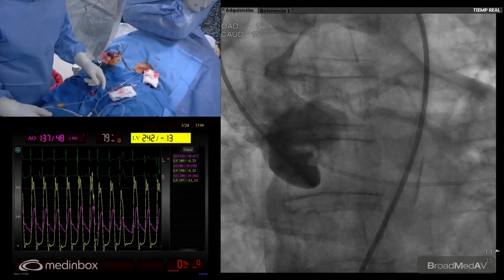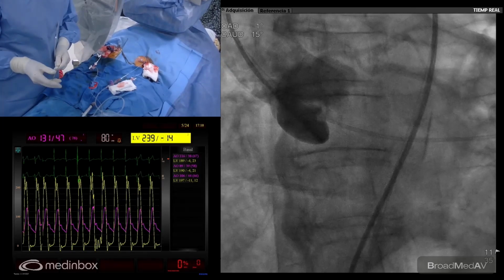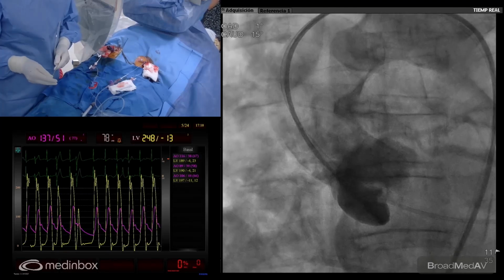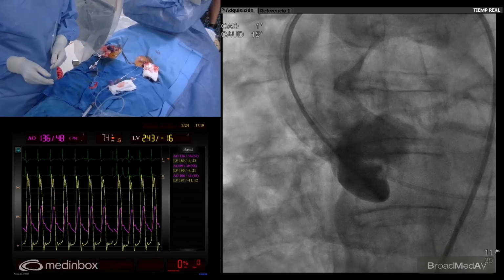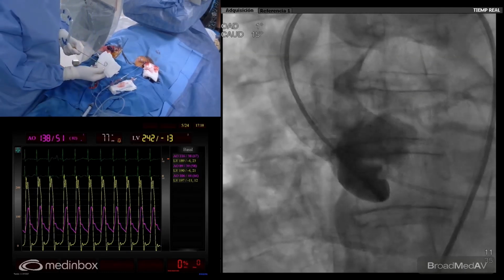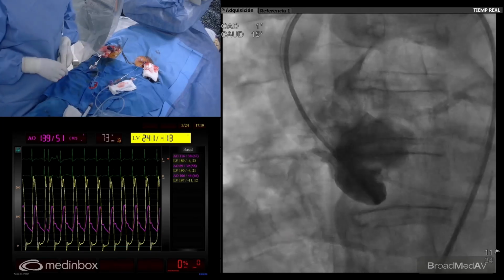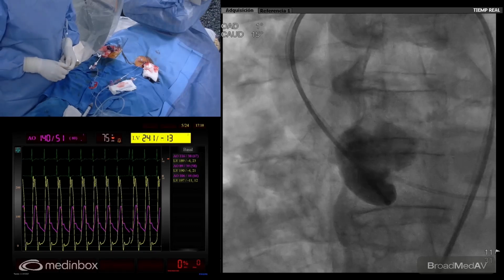Okay, so we have configured the wire here. As always, we try to reshape, especially for small ventricles, to make it as small as I can. I will try to show you. Give me a white. It's perfect. So here in the camera, you can see that we have downgraded. Now it's probably, this is my finger, 2 centimeters. And then one additional shape here, especially in this case for a very angulated aorta.